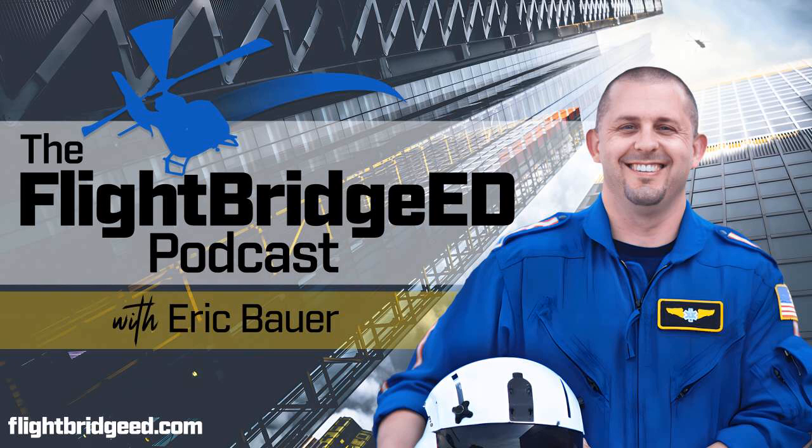The first thing I do when I walk in to a balloon pump transfer is I want to know, number one, the balloon size. The balloon size is very important, and when you look back maybe 5 years ago, and I'm just throwing a number out there, it could have been 3 years ago, it could have been a little longer, it was very, very common to see most adult patients having a 40 mil balloon. And now we're seeing cardiologists using these mega balloons, these massive balloons, or what are called 50 mil balloons.